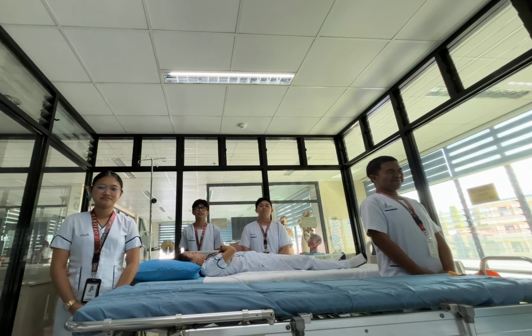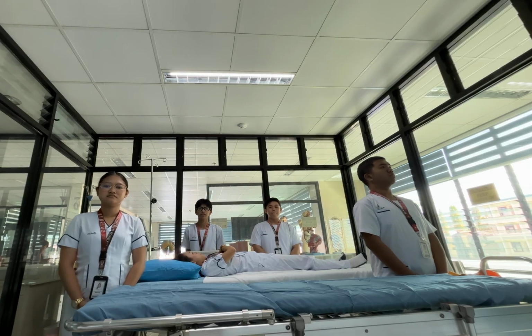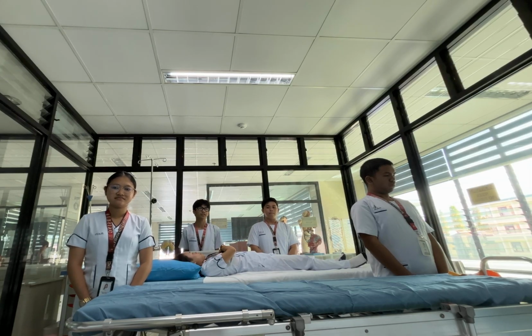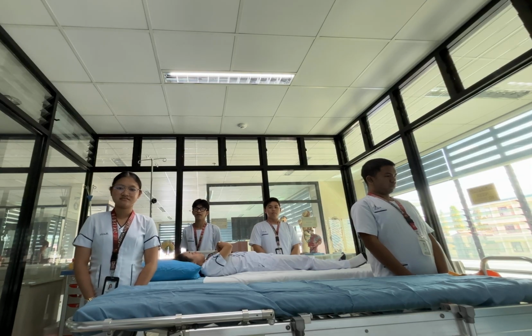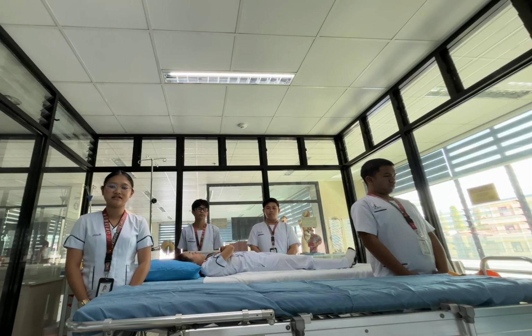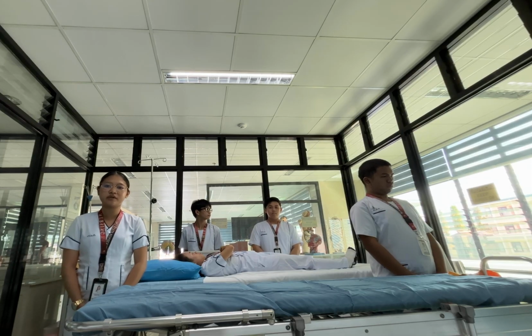The definition: assisting from bed to a stretcher means safely moving an immobile or weak patient laterally from a hospital bed to a stretcher, usually requiring 3 to 4 staff members and assistive devices like a transfer board or draw sheet. The procedure involves aligning surfaces, locking brakes, and using coordinated ergonomic movements to minimize friction, protect the patient, and prevent staff injuries. For the objectives: first, ensure safety for both the patient and the caregiver; then minimize injury risk while transferring; and lastly, promote patient mobility.